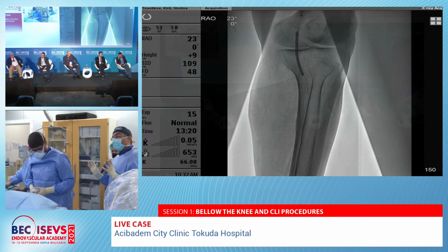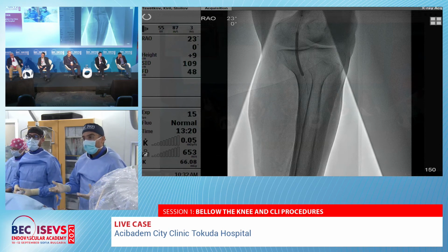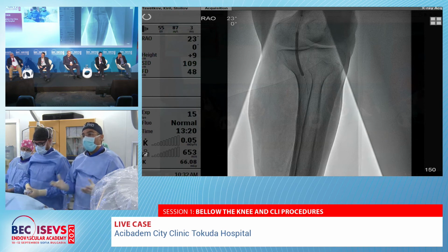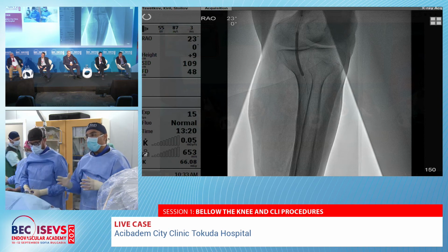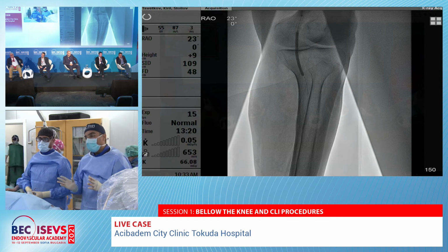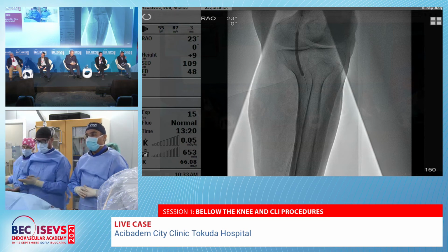In case that you are in trouble and you have concerns about thrombus, the best strategy, if you don't have distal protection devices or any thrombectomy devices, the best protection would be to go slowly and start dilating with 3 to 4 to 5 millimeter, just to try not to fragment the whole clot. And we will see how it looks after each angioplasty, and then at the end we will decide if we go for stenting or if we have any other trouble here.